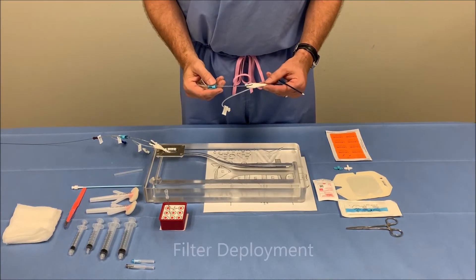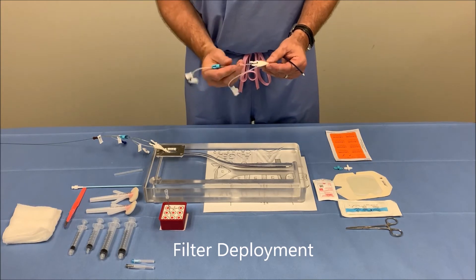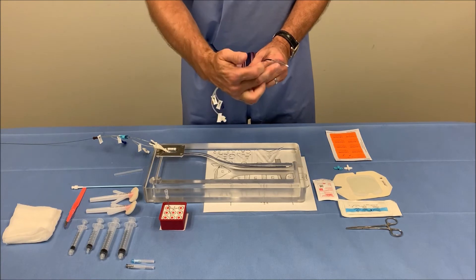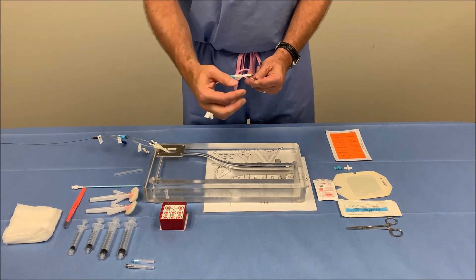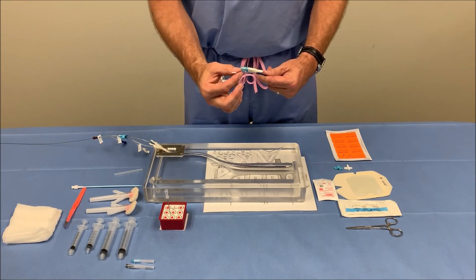To deploy the filter, we will retract the white portion of the locking hub to the teal portion. By retracting the white portion of the locking hub, we will be unsheathing the filter, exposing the radiopaque marker at the distal tip as well as the proximal tip and the nitinol filter.